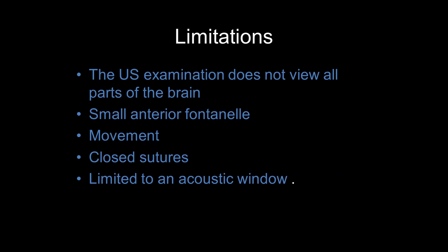Great, thanks for that. The next question we have for you is, why would you assess MCA versus ACA? I think that there's no difference in which one you choose. I think the anterior cerebral artery tends to be easier to teach. So that's why I tend to use the anterior cerebral artery versus the middle cerebral artery. So it's a matter of preference, which one you find easiest to get.